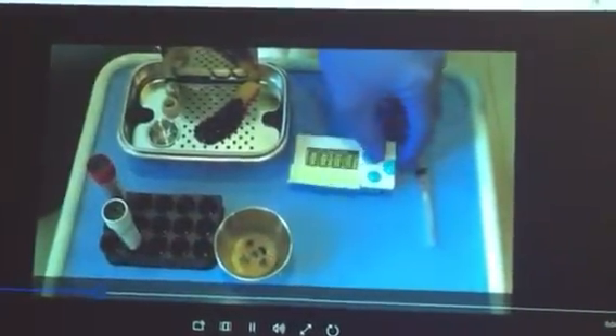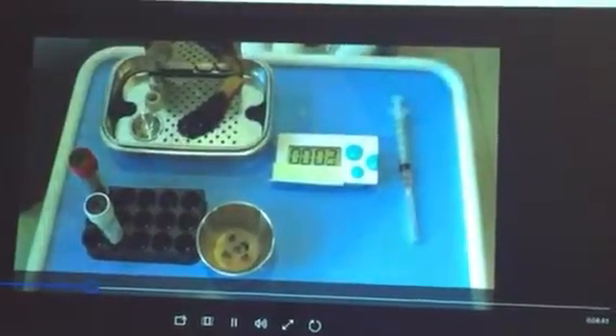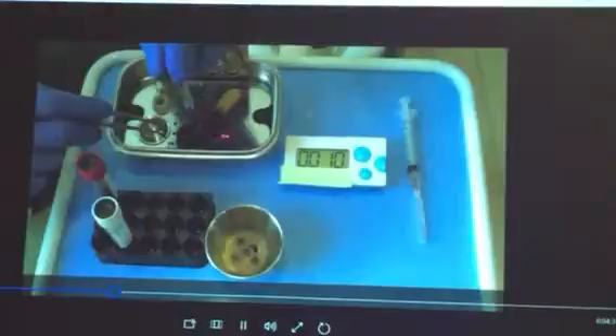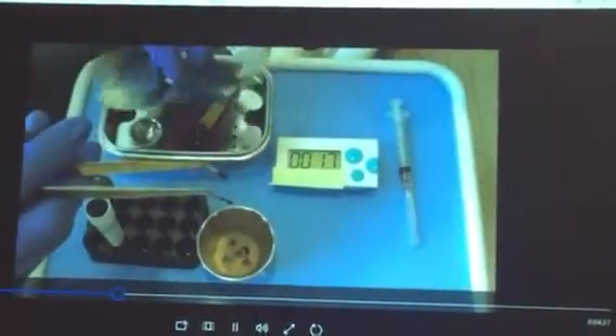We're going to shake it around a little bit. Get the timer going. Now I'm separating the red part here and just dumping it into the bottom of the tray. Try to get as much of it as possible — if you have a little bit left in there, that's fine.